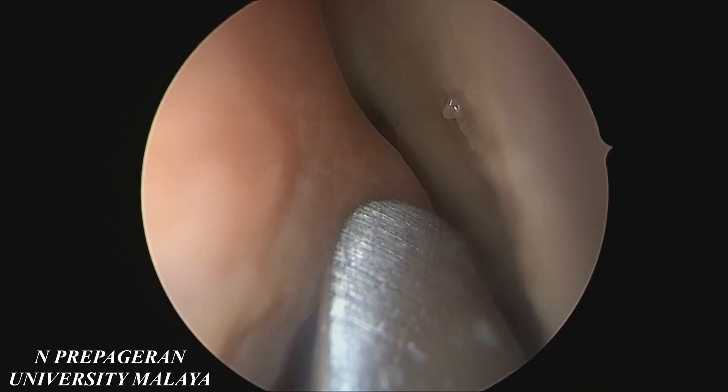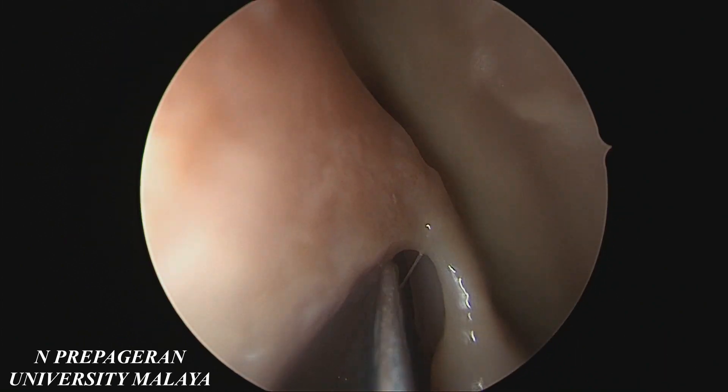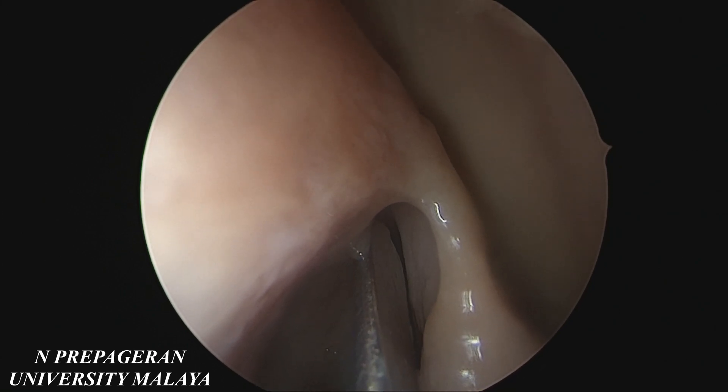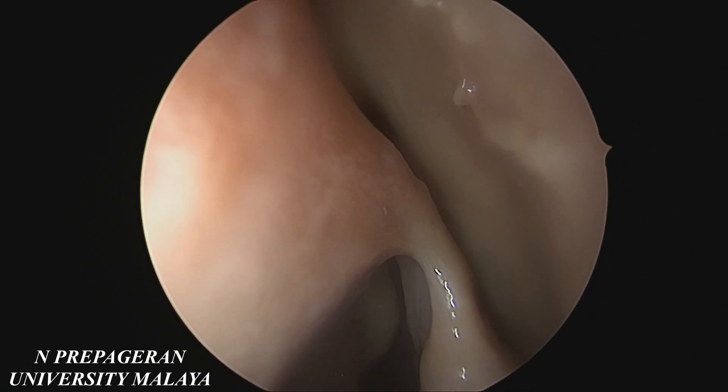Where does skull base start? All this is not skull base — this is nasal bone. The skull base will only start after the bulla, which roughly corresponds to the posterior wall of the frontal. So all this is not skull base, it's just the nasal bone.